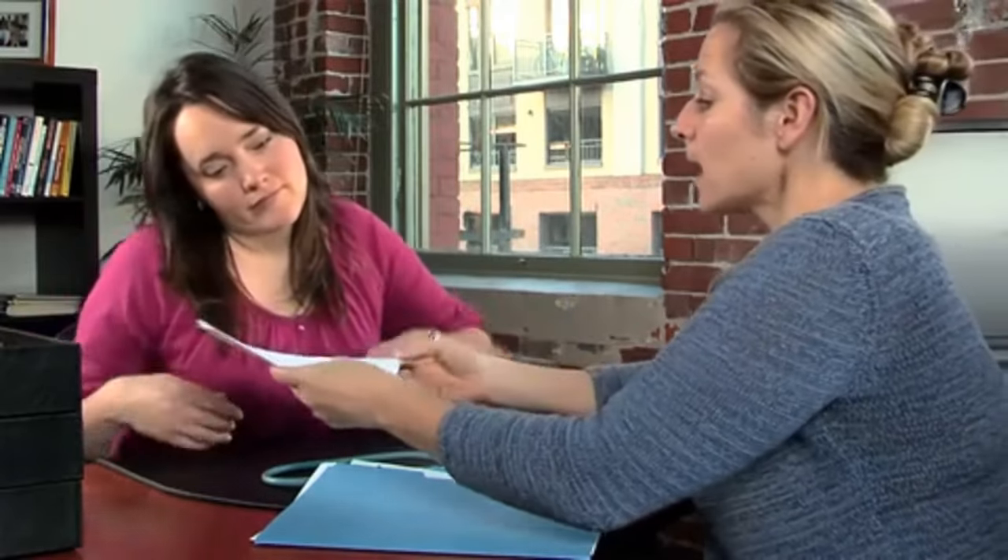Your healthcare provider will explain what happens during the procedure and will also talk with you about any risks or complications that may occur. You'll be asked to sign a consent form that gives your healthcare provider permission to do the procedure. Read the form carefully and ask questions if anything is not clear.